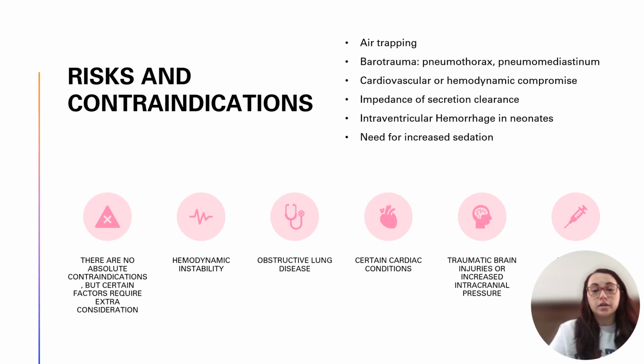And then with the oscillator, not necessarily in the preemie population or your NICU population, but in bigger kids and adults, since you are not breathing in a way that would feel natural, they may need increased sedation. So if you have a patient that you don't want sedated, you need them to be moving around, you need them to be mobile, then the oscillator may not be the best choice, since mobility is limited with the oscillator due to the circuit, the risks of disconnection, and how it works.